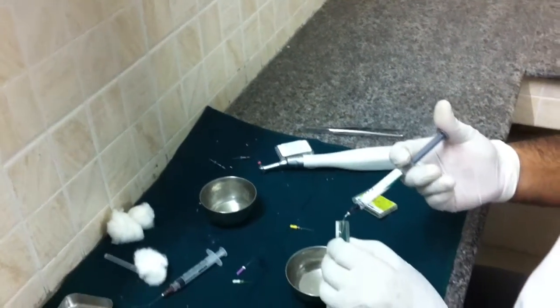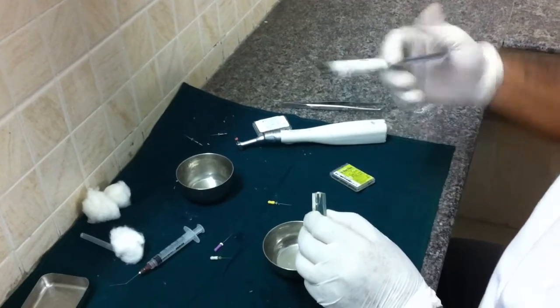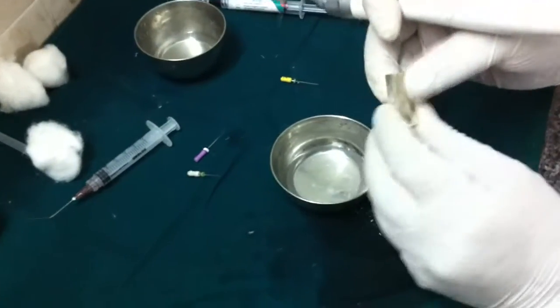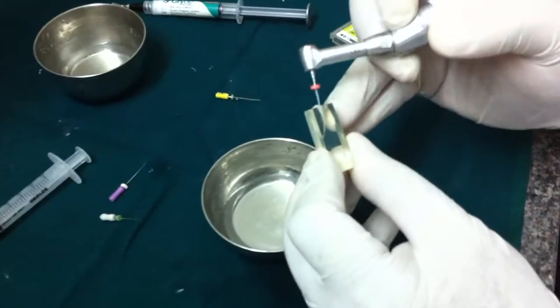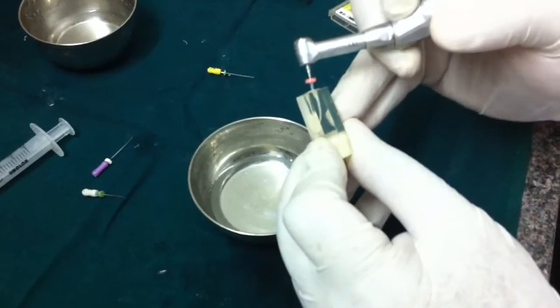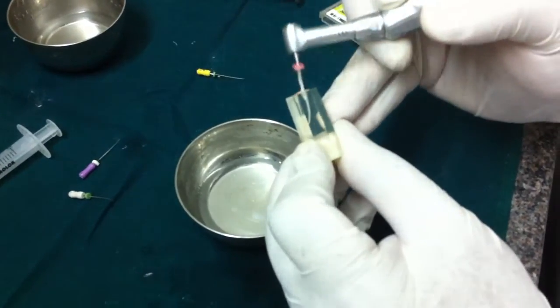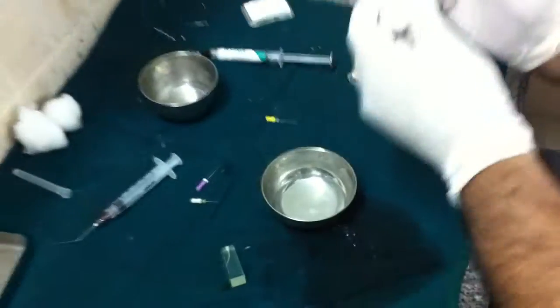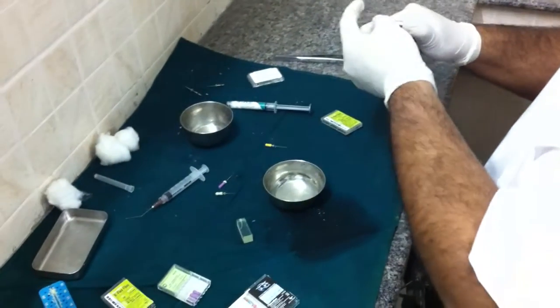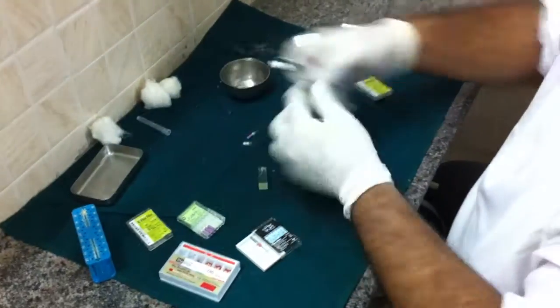Introduce EDTA. Gentle withdrawing motions. If you notice here, gentle withdrawing motion, no pecking action. Just go inside and gentle withdrawing motion. Now irrigate with saline.